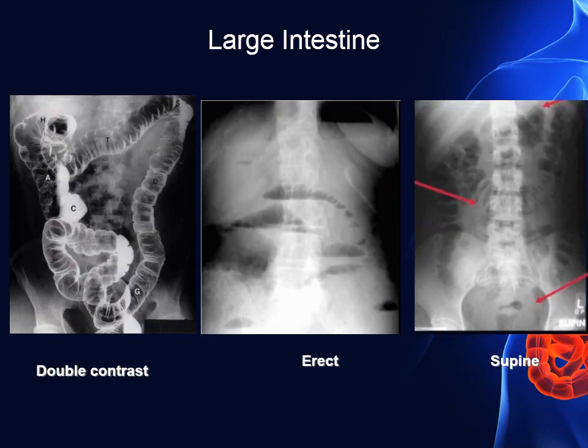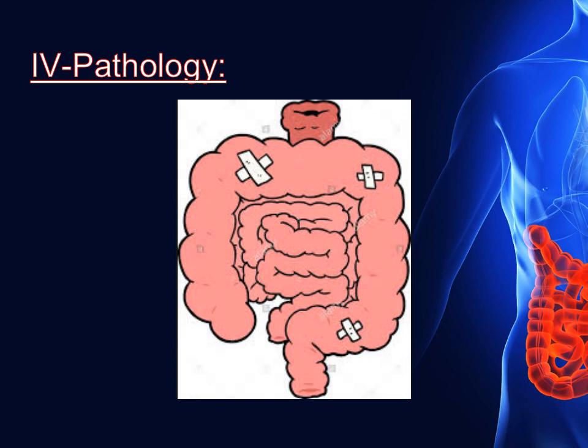Here is the large bowel: the first image shows double contrast, with the contrast making a thin film delineating the wall and the gas in the center. The other two pictures show plain X-ray — erect with the air-fluid level, which is acceptable, and supine showing an inverted U-shape gas with characteristic haustration of the large intestine. Any deviation from the normal will be a pathology.